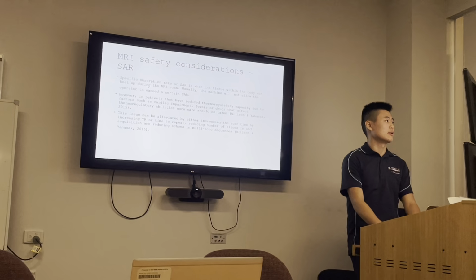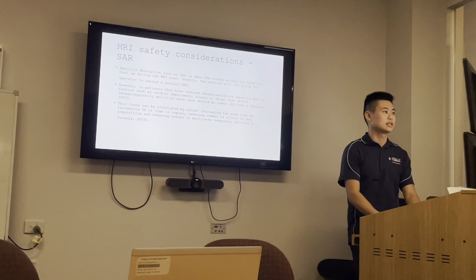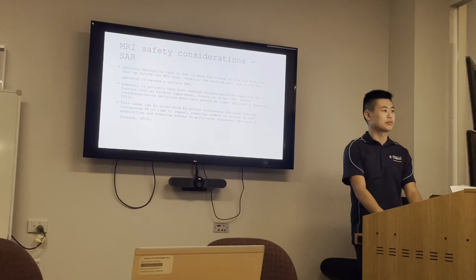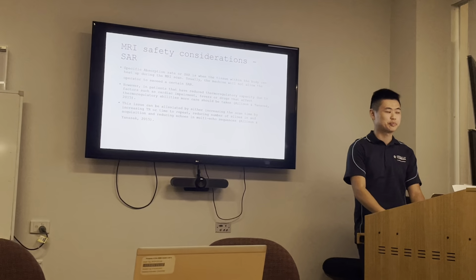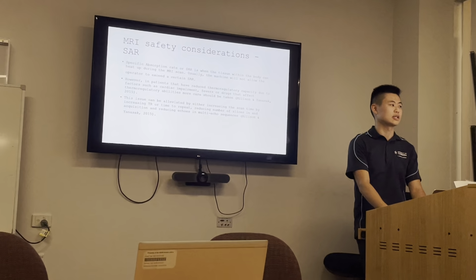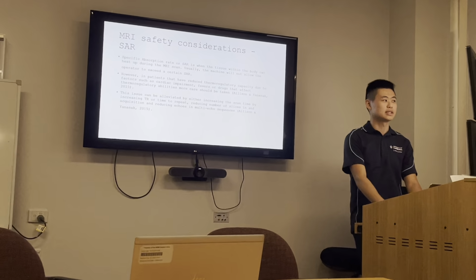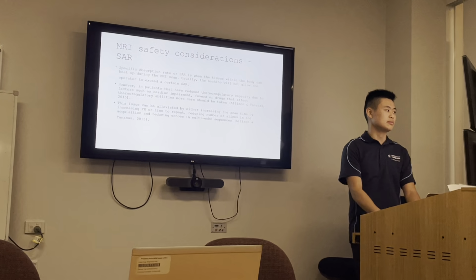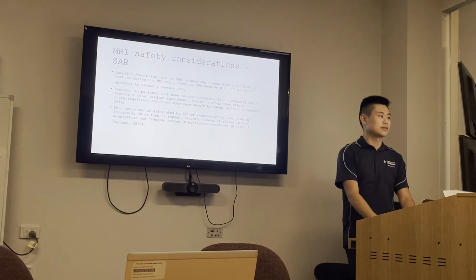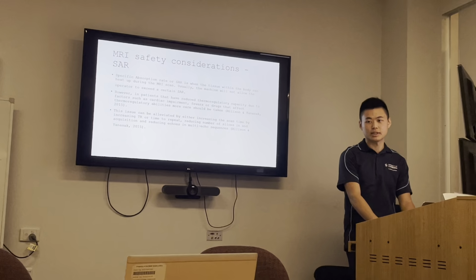So these are some MRI safety considerations. SAR, or specific absorption rate, is when the tissue within the body can heat up during the MRI scan. Usually the MRI scanner will not allow the operator to exceed a certain SAR. However, in patients that have reduced thermoregulatory capacity due to factors such as cardiac impairments, fevers, or drugs that affect thermoregulatory abilities, more care should be taken. The issue can be alleviated by increasing the scan time, by increasing the TR or time to repeat, reducing the number of slices in the acquisition, and reducing echoes in multi-echo sequences.